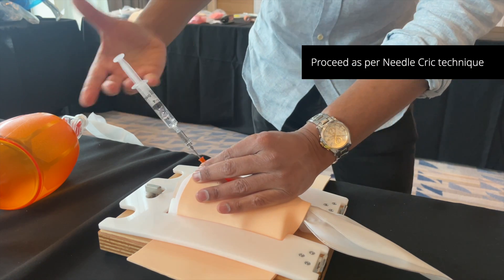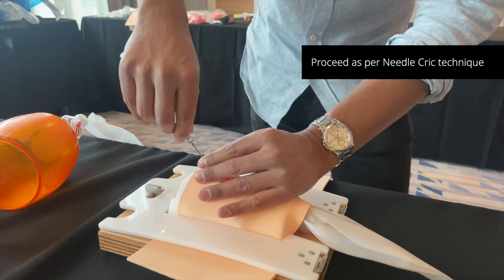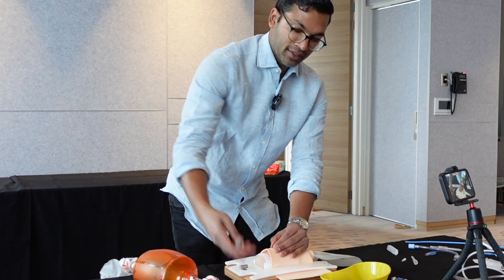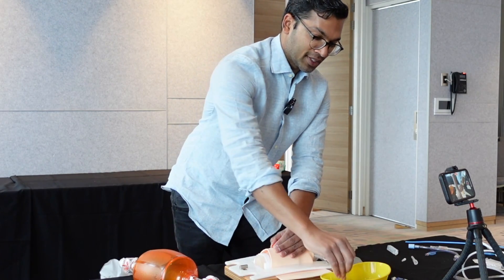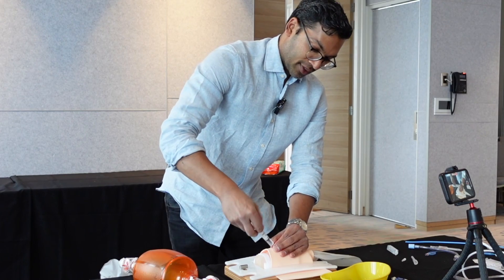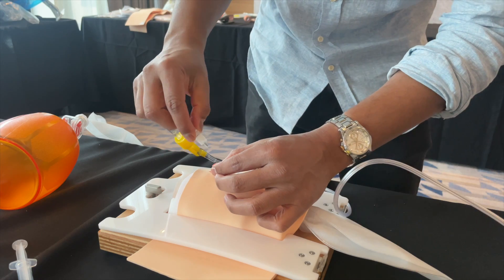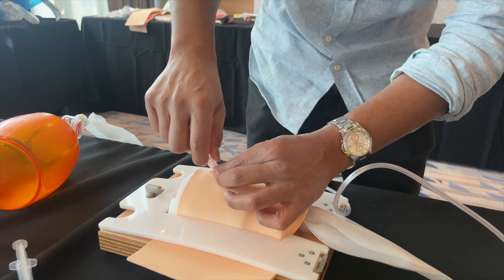This is exactly the needle crike technique as taught before. Take the needle out and put it safely in a sharps container. Aspirate for air — it confirms I'm in the right position. Then connect this to a jet ventilation device.